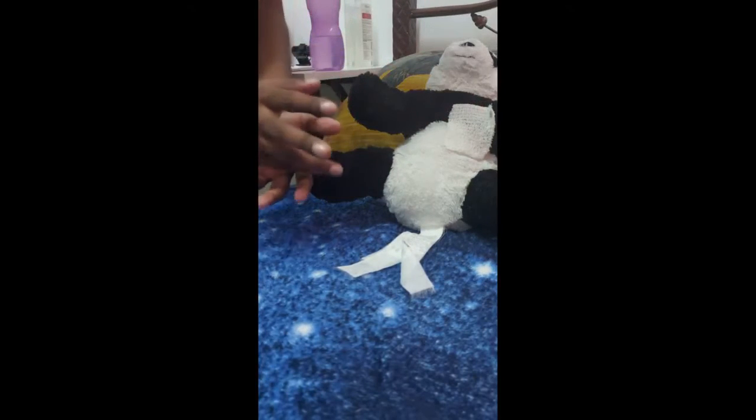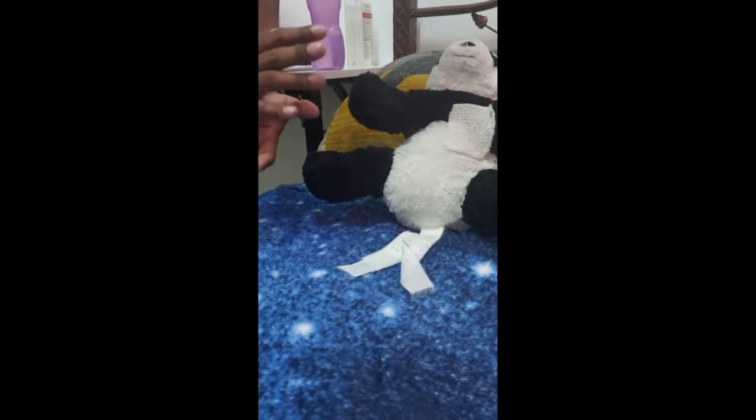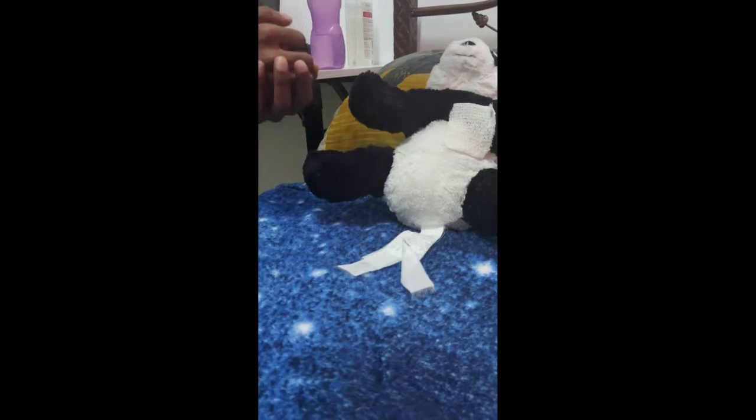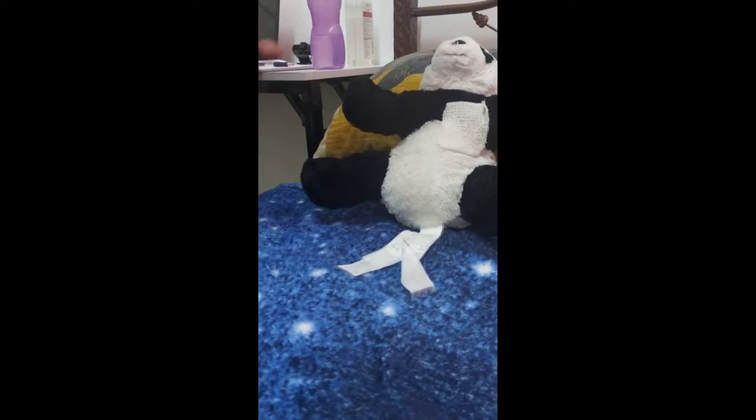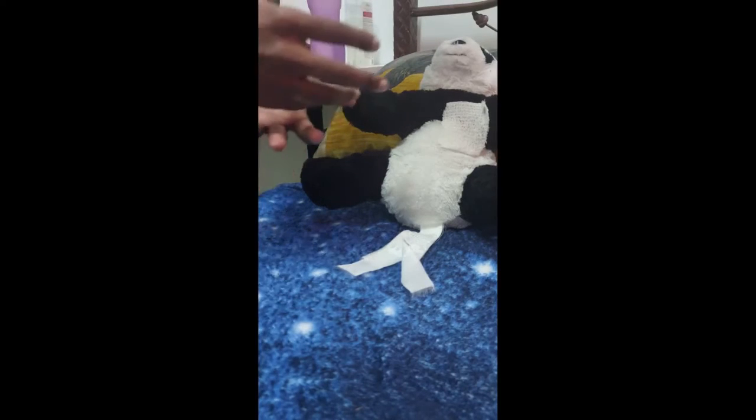Another thing that you will have to report to a nurse is if the patient has hiccups. So, sir, have you been facing any hiccups? No, sir. Okay, that's good. If there are hiccups, it could indicate that there may be some problems with the surgery, or maybe there might be some problems with the pacemaker.